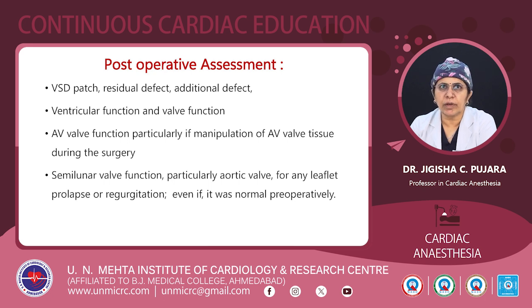Post-operative assessment: VSD patch, residual defect, additional defect, everything should be checked properly. Ventricular function and valve function should also be checked, particularly AV valve function when there has been manipulation of the atrioventricular valve tissue during the surgery. Sometimes for the closure of the VSD, the surgeon detaches the tricuspid valve septal leaflet and reinserts it. During that, sometimes either tricuspid stenosis or tricuspid regurgitation can occur. So one should check all these things, not only focusing on the patch and the VSD closure, but see other things.